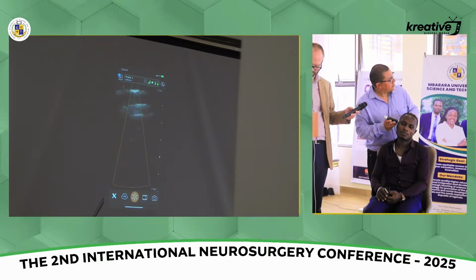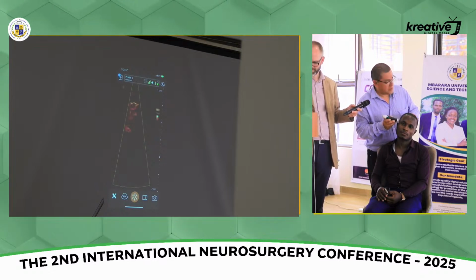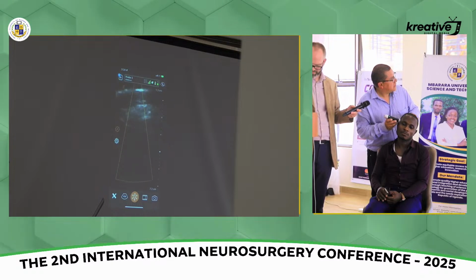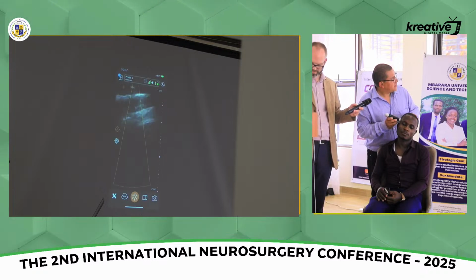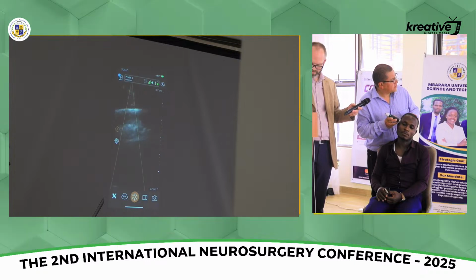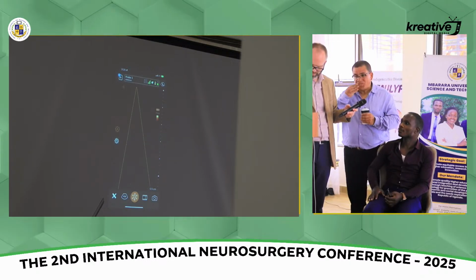Yeah, I'm not seeing it. Yeah. Kind of a little bit more anterior, perhaps. I mean, it's penetrating for sure, but maybe if you decrease the gain distally. But we can always try with the machine that you have at the hospital, which may be easier to handle. Yeah, well, that's the principle, anyways. Okay.